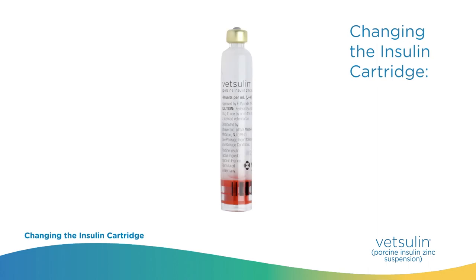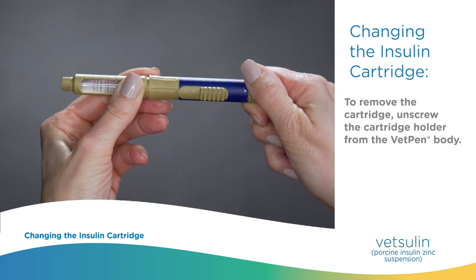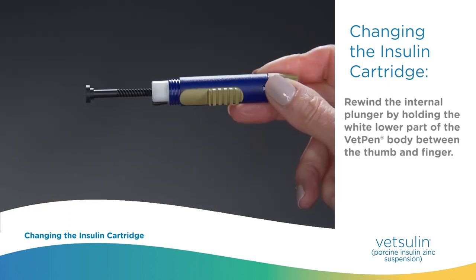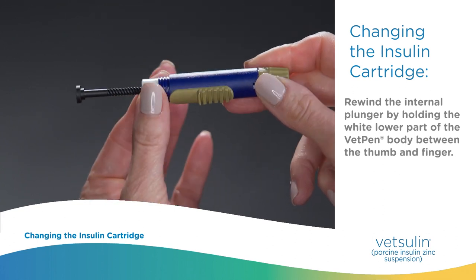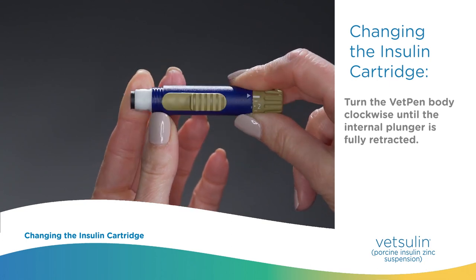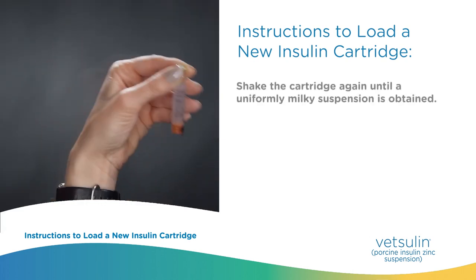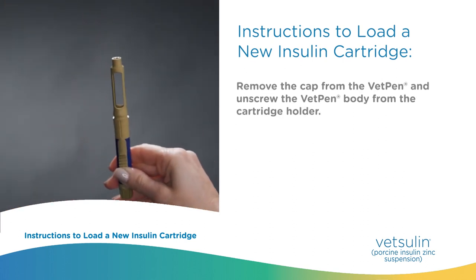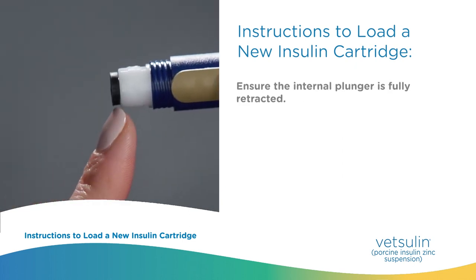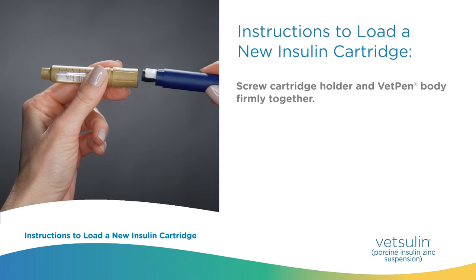Changing the insulin cartridge. Prior to changing the insulin cartridge, always ensure the needle has been removed to prevent accidental injury. To remove the cartridge, unscrew the cartridge holder from the VetPen body. Rewind the internal plunger by holding the white lower part of the VetPen body between the thumb and finger, then turn the VetPen body clockwise until the internal plunger is fully retracted. Shake the new cartridge until a uniformly milky suspension is obtained. Remove the cap from the VetPen, unscrew the VetPen body from the cartridge holder, ensure the internal plunger is fully retracted, load the insulin cartridge with the metal cap first, and screw the cartridge holder and VetPen body firmly together.